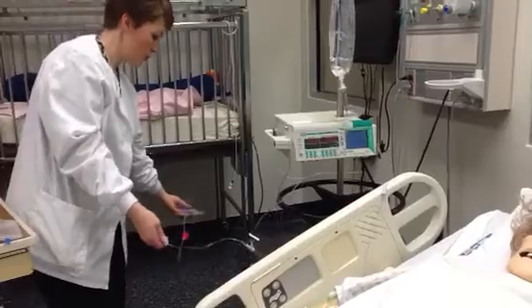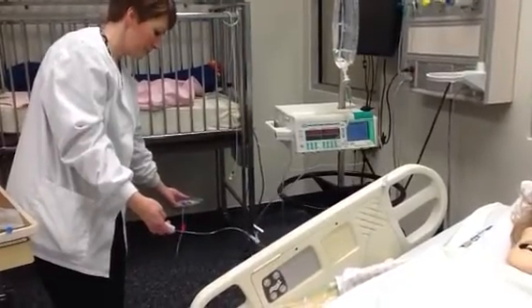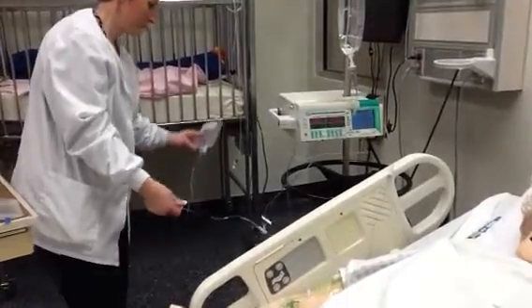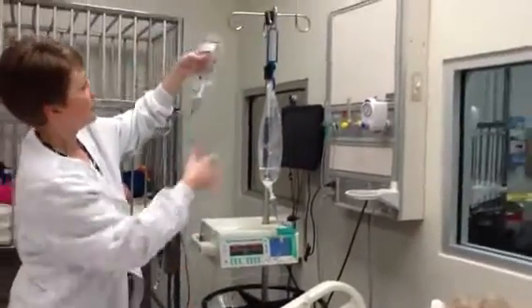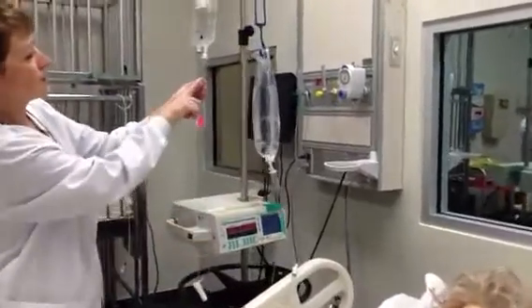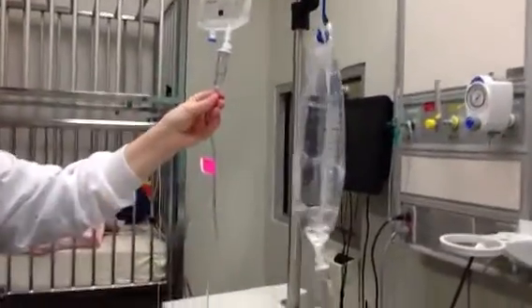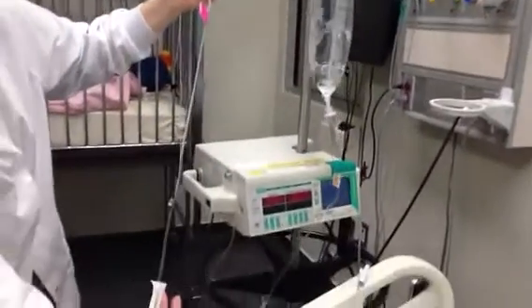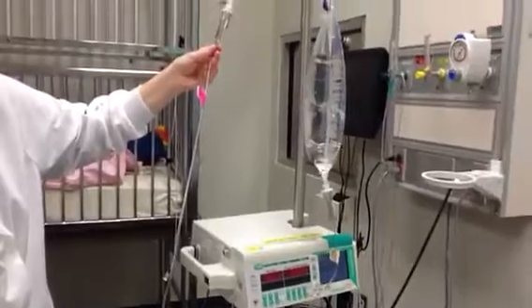So I'm going to open up my clamp. And now, if you can see here, because I backflowed it, my chamber is filled, and I no longer have air in my tubing. Okay?